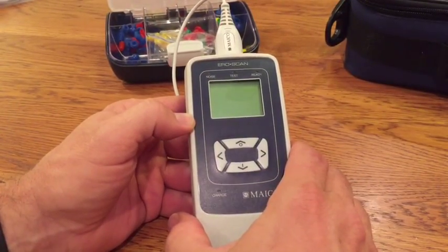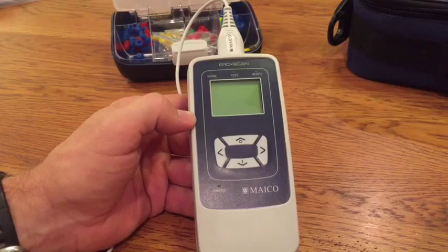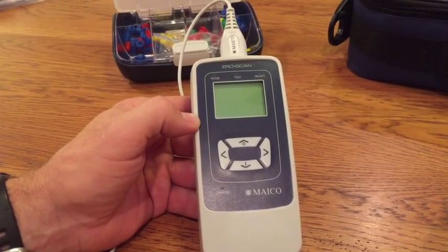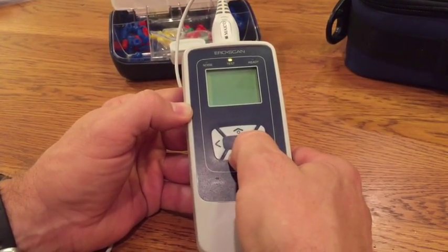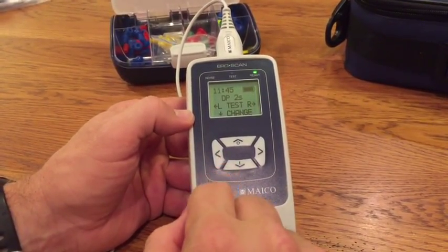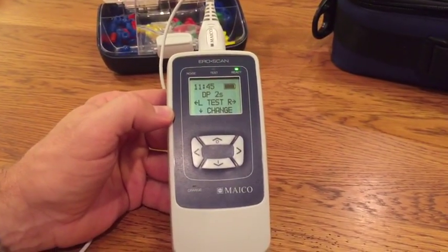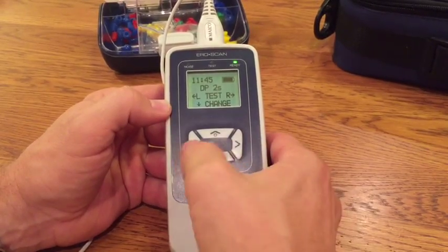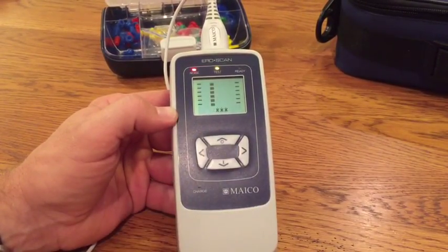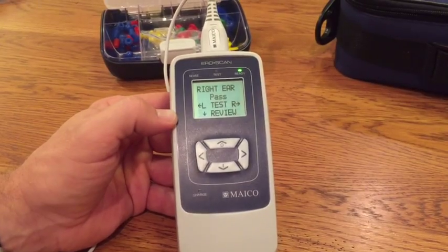One important consideration with this equipment is screening children who are known to have PE tubes. To test children with PE tubes, the auto start needs to be disabled. First insert the probe with the appropriate ear tip into the ear canal and get a good fit. Then press the down button to turn the machine on, and select either the right or left arrow key and hold it down for three seconds until the green ready light turns off. Once the key is released, the machine will calibrate and test as before.